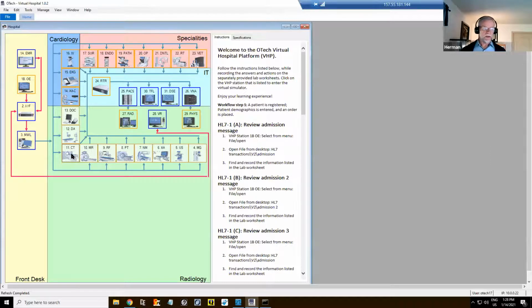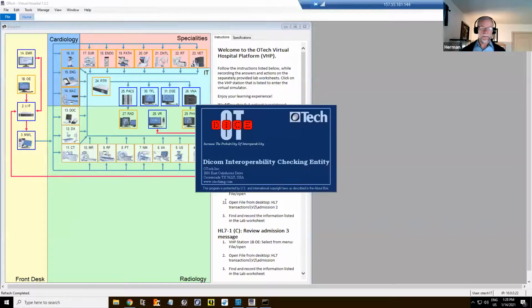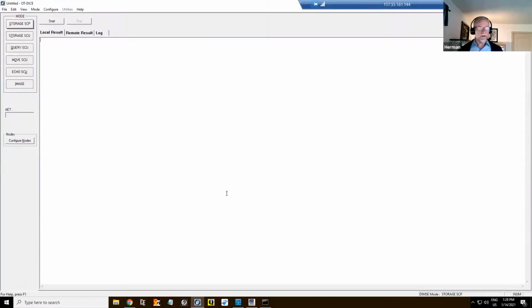So let's say we have a modality simulator. In this case, it's called OT-DICE. The modality simulator is on virtual machine 1. Basically, we're going to do a simple verification first. Remember an echo, which allows us to set up the connection, and we do the transfer. In this case, we'll do an echo, and then a simple release again, right? So this is the simulator, and we're going to go talk to the PACS.